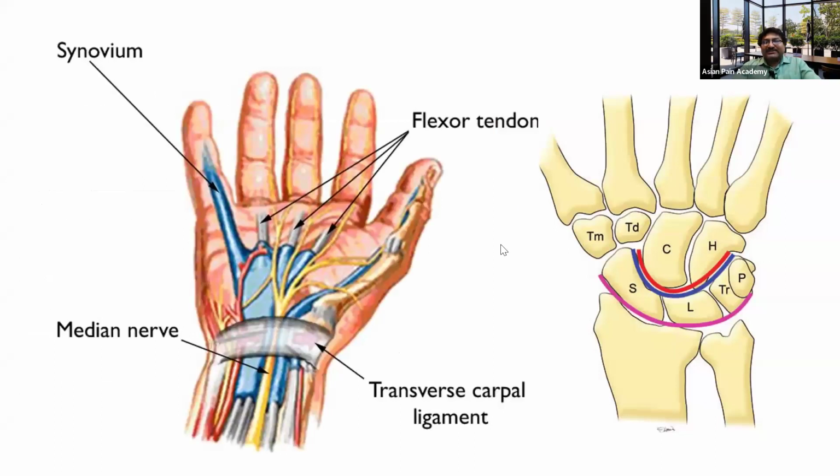Remember, we always read the bones like this. Okay, that means from proximal to distal: scaphoid, lunate, triquetrum, pisiform, then trapezium, trapezoid, capitate, hamate. But as these cuboidal carpal bones are not always placed in a two-line fashion, some carpal bones are longer and some are shorter. So while scanning this bony margin, usually we cannot see four of these carpal bones together.